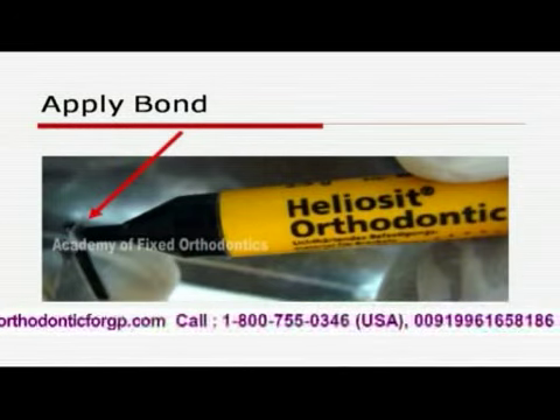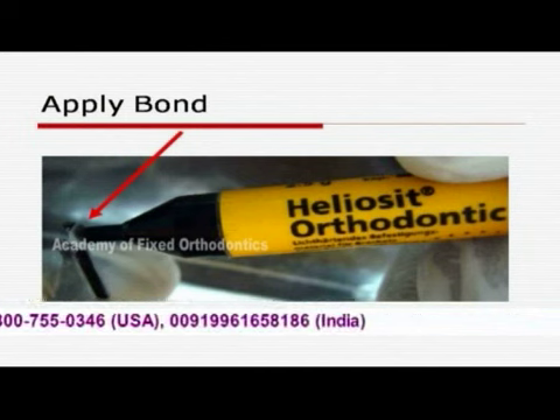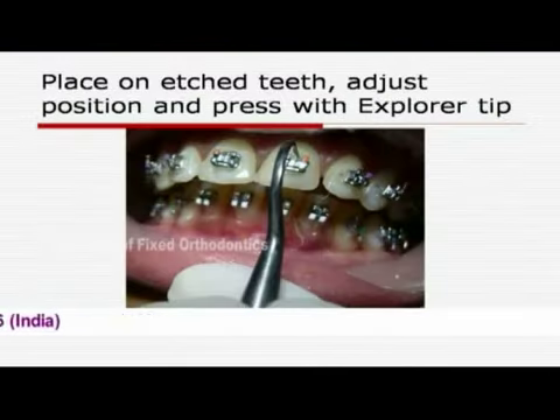This is the Heliocyt Orthodontic from Ivoclar Vivadent. You just place it on the bracket base and then press it onto the tooth.